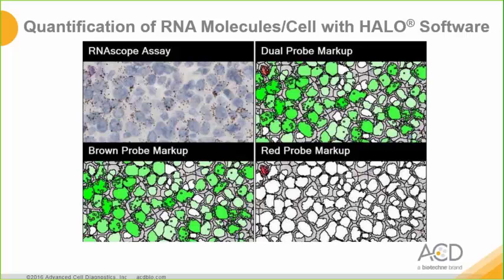As I mentioned earlier, not only can HALO analyze images from RNAscope singleplex assays, but also more complex expression data generated with the RNAscope duplex and multiplex assays. Again, the software picks up cell nuclei based on hematoxylin staining and then identifies cell boundaries through approximation of average distances between the cell nuclei. Dots are detected based on pixel colors. HALO allows for real-time tuning of analysis settings. The algorithm then counts dots within each cell and bins and highlights each individual cell nucleus based on dot count into the categories, or bins established. In the markup, darker shades indicate higher spot counts, while white nuclei indicate 0 dots.